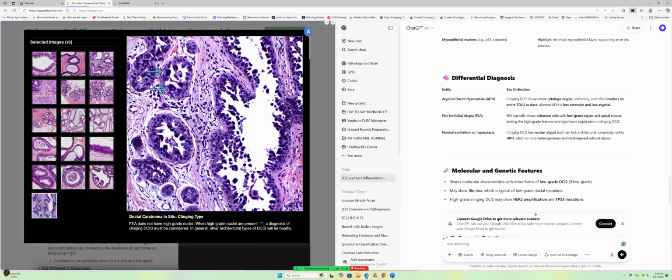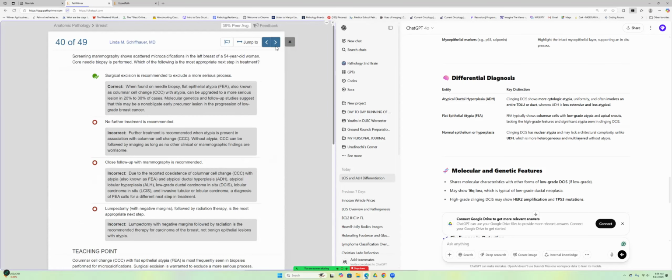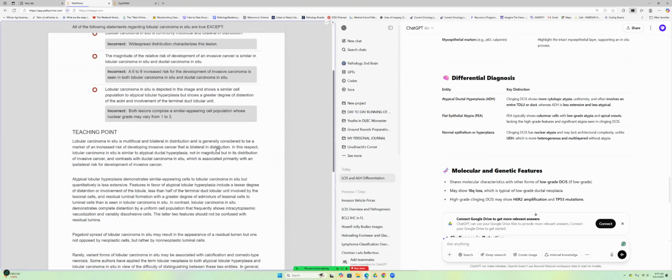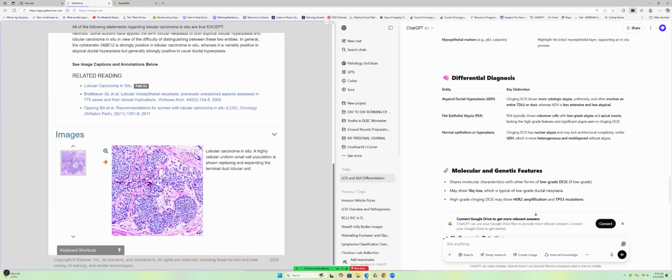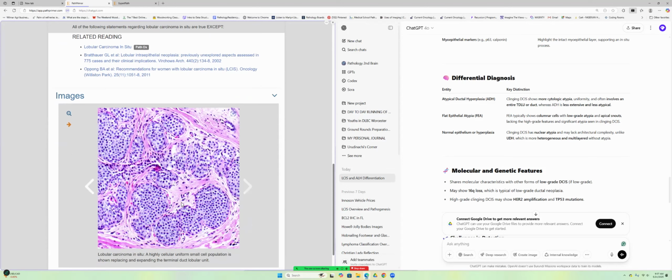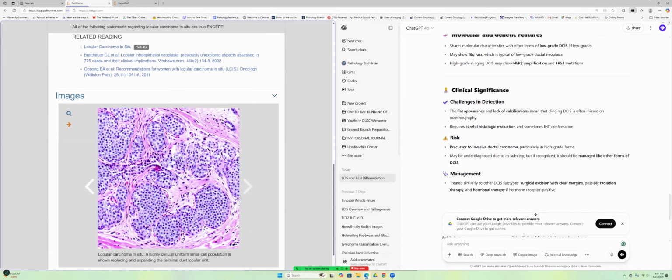Now you see this in what skin disease again? You remind me again. Paget disease, also known as what? I've forgotten the other name. So is this LCIS or ALH? This is LCIS. Very good.